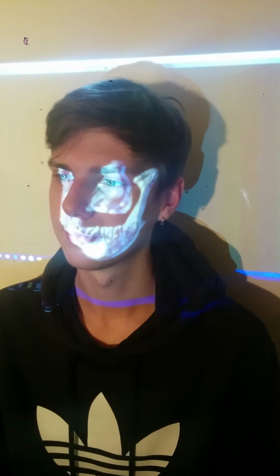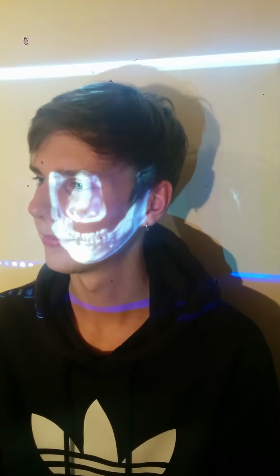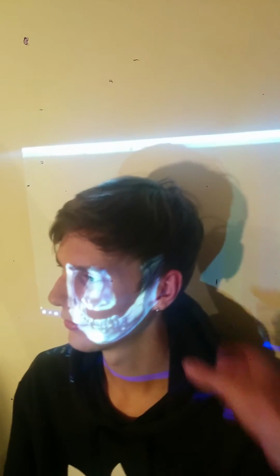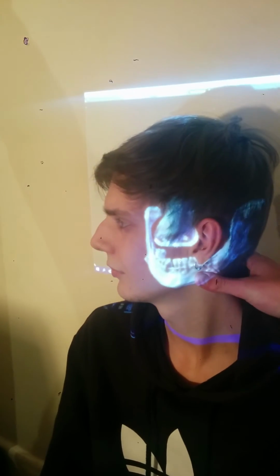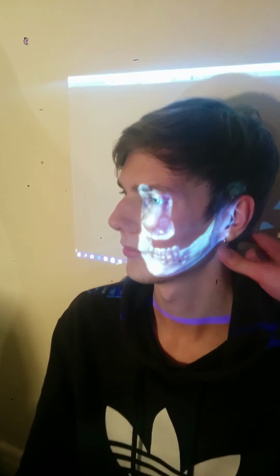If the patient now turns his head to the right, very slowly, you see that it will track. There is a delay in the tracking. This is due to the location that you put the system in. And at every point, you will just need to realign the patient's face if you turn it slightly too far. And this is due to the patient's center of rotation axis being different to that of the rotation axis in Blender.